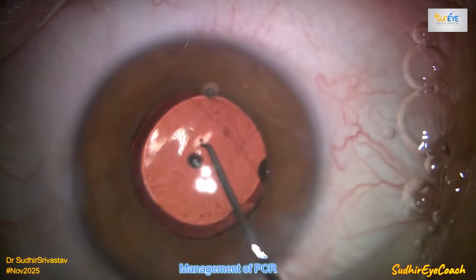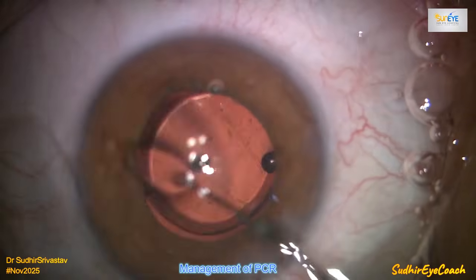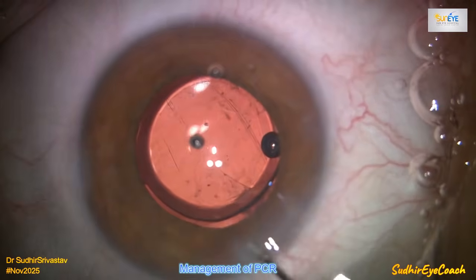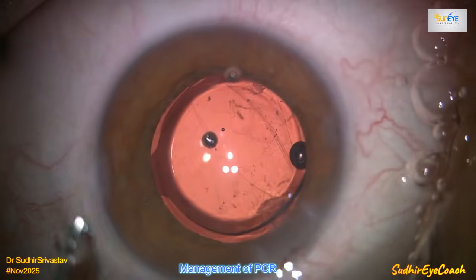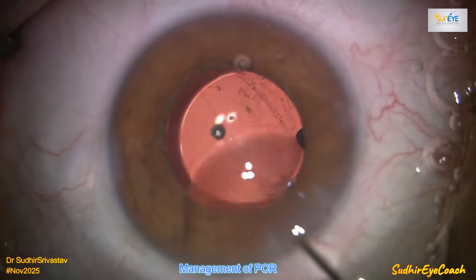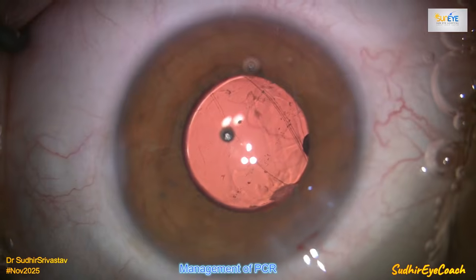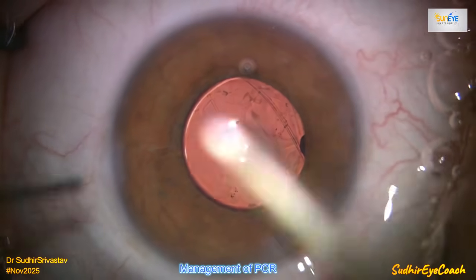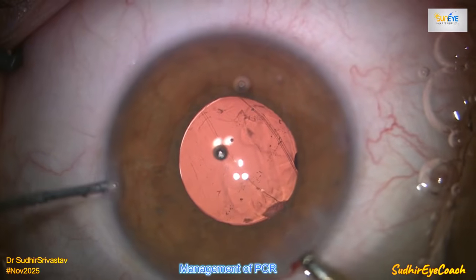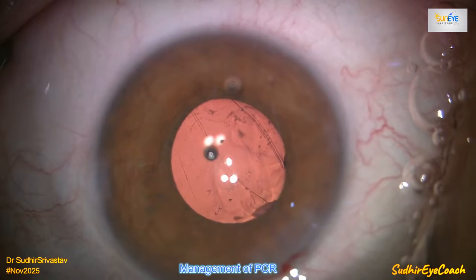In the end, it was very reassuring, because despite the large rent, I was able to remove all the cortical matter and implant the lens securely in the bag, and it was well centered, and the patient was very happy the very next day. Sometimes the day simply doesn't go your way, and a routine case can certainly turn into a challenge, but what truly matters is how you manage the situation and how you come out of a complication. If you are operating, complications are part of surgical life. They will happen. The mark of a good surgeon is not the absence of complications, but how calmly and skillfully you handle them.